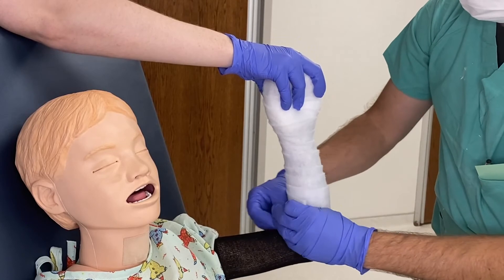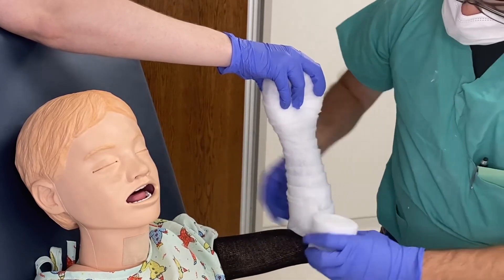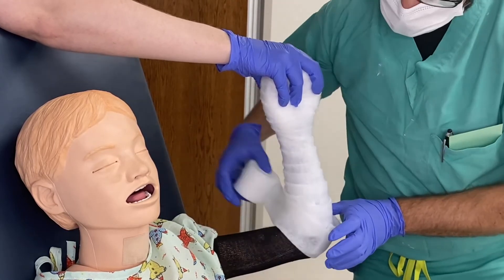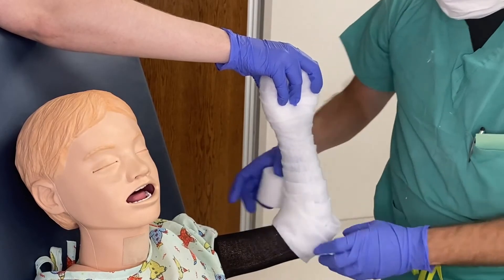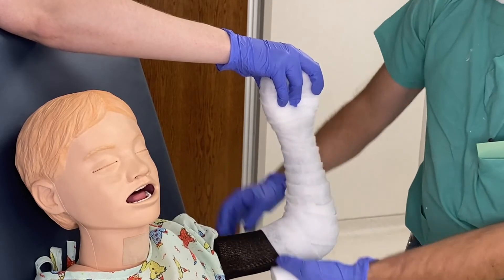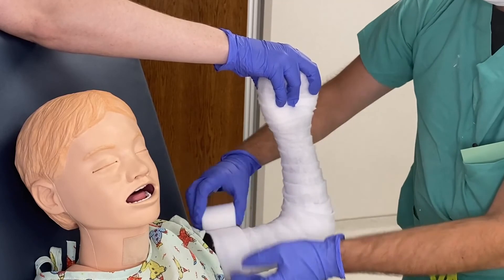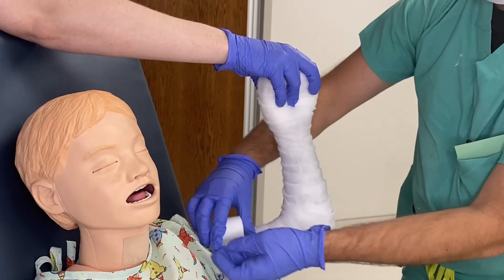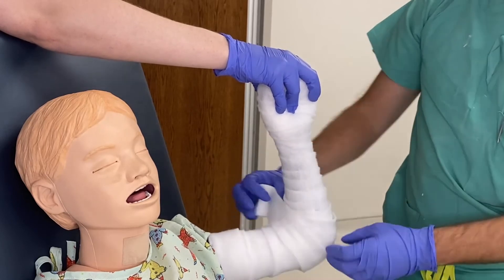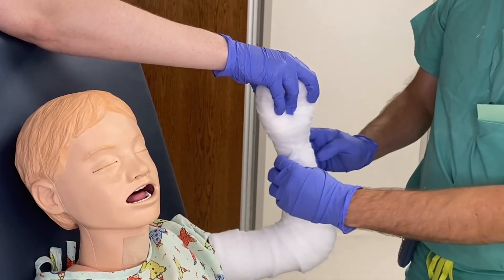Make sure your layers are nice and even. Remember to get down to the elbow — we're going to fan fold the elbow, fan folding every bony prominence. Do a figure eight to capture it, then going up the arm 50-50, going around three or four times, then work your way back. Do about three layers right here, making sure there is sufficient padding.